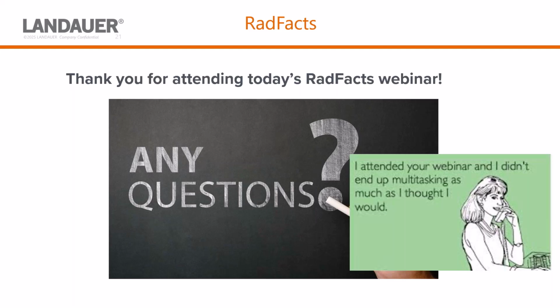What are the ALARA default numbers? There is an ALARA recap, and I wish I had it on my screen, but if you get an ALARA recap report, it has your ALARA levels on there.